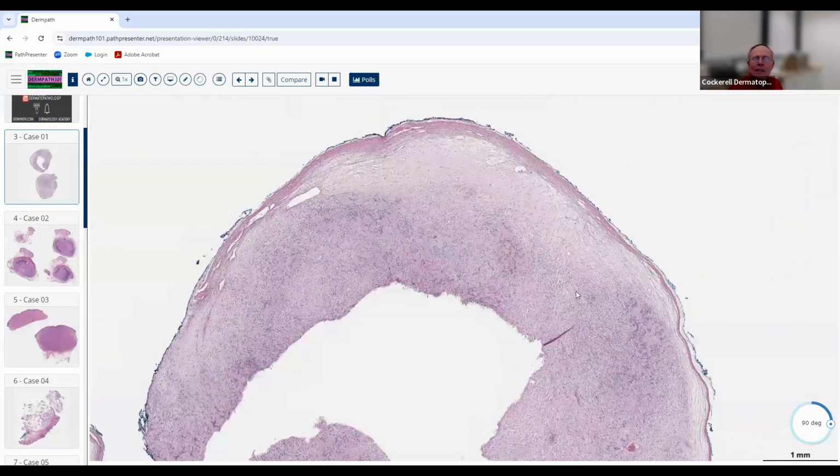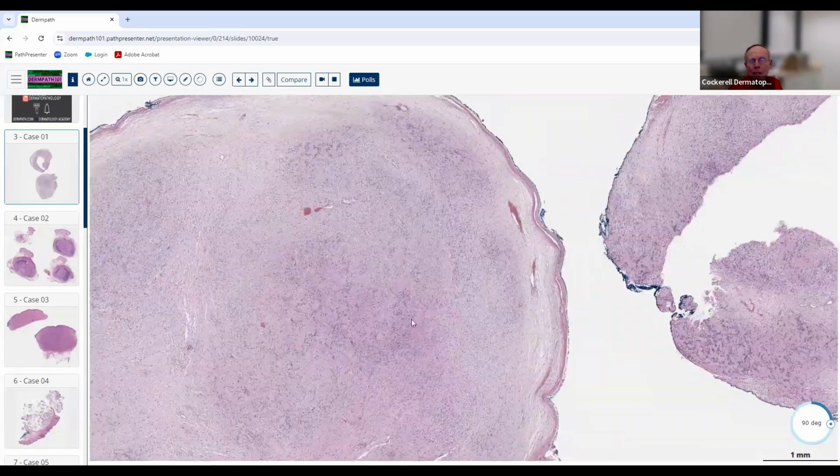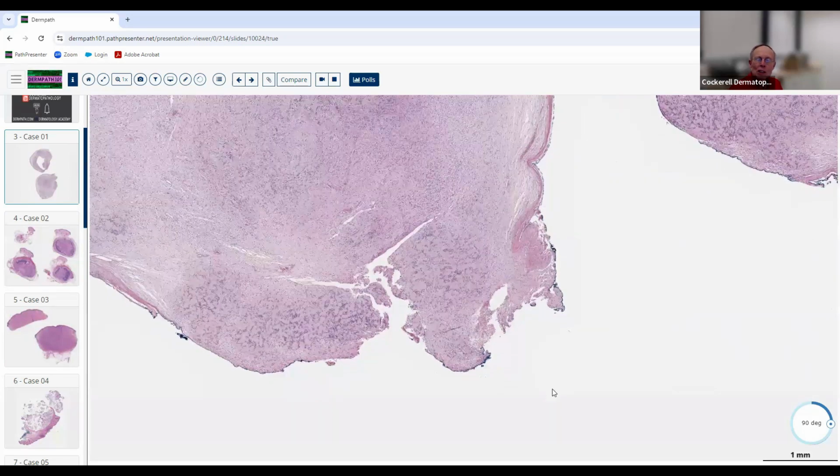The way these lesions develop, a way you can think about it, is if you were small enough to go inside a nerve twig and set off a hand grenade and it exploded, that would be like a neurofibroma, because the center of the nerve twig just becomes massively expanded, and the Schwann cells and the mucinous stroma are there, and you don't really see any Verocay bodies.